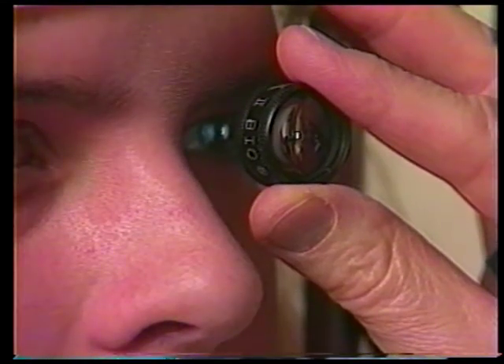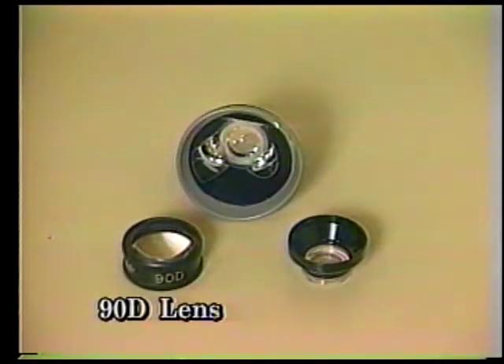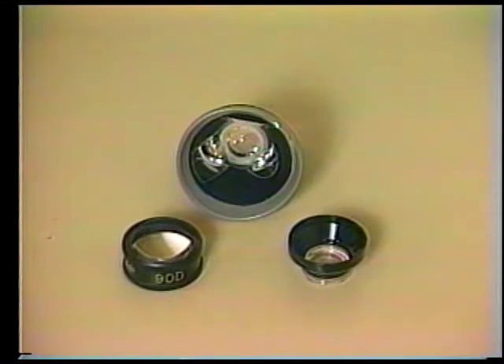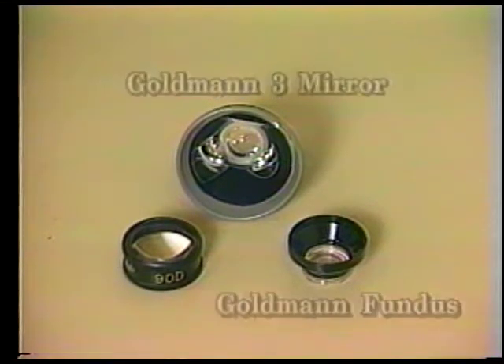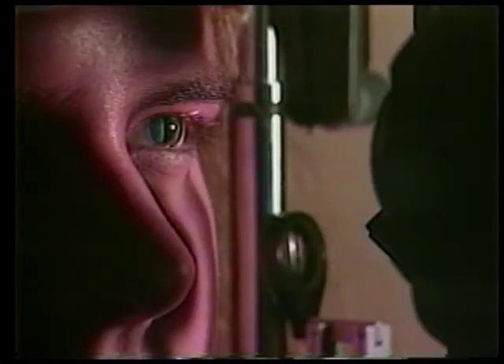The slit lamp provides an excellent way of evaluating the posterior pole of the retina — that is, the optic disc, macula, and major vessel arcades — with a magnified three-dimensional view. This can be accomplished by one of three methods. These lenses are needed to neutralize the refractive power of the ocular media so the slit beam can be focused on the retina. The best exam is achieved with a dilated pupil. However, with practice, the 90-diopter lens can be used without pupillary dilation.